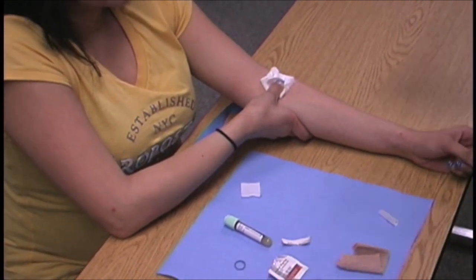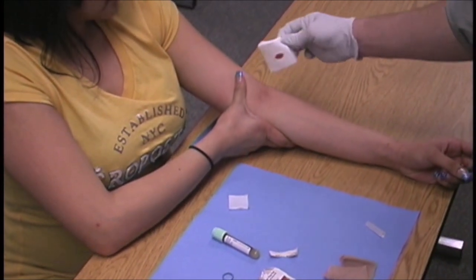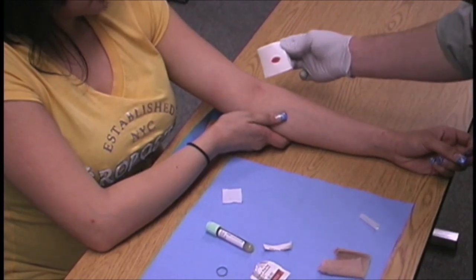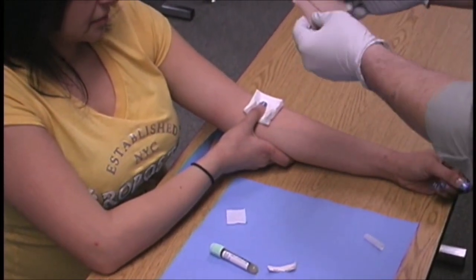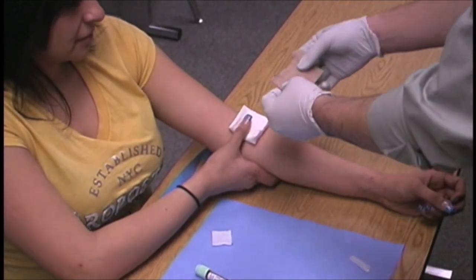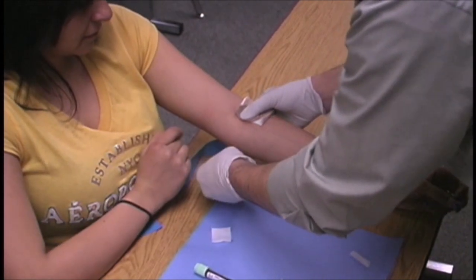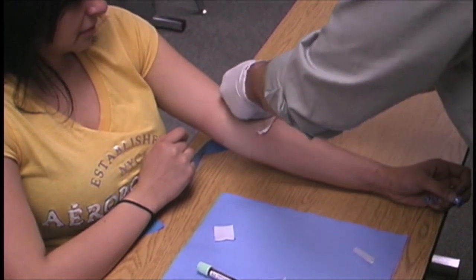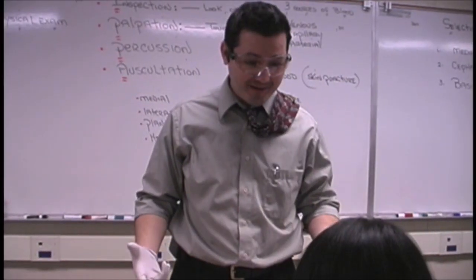At the end of three to five minutes, Al lifts a corner of the two-by-twos and looks for stasis and control of bleeding, and checks for any mounding of tissue. If there is none, he puts the two-by-twos back down. He picks up his co-band — a stretching bandage — and wraps it around the two-by-twos to hold them in place. The two-by-twos are the dressing; the co-band is the bandage.